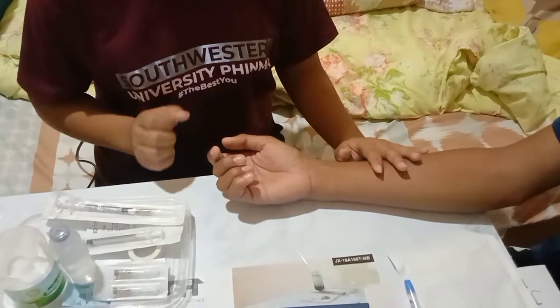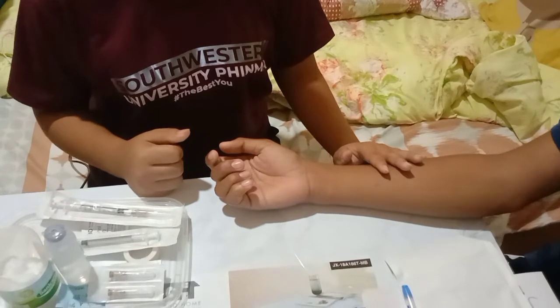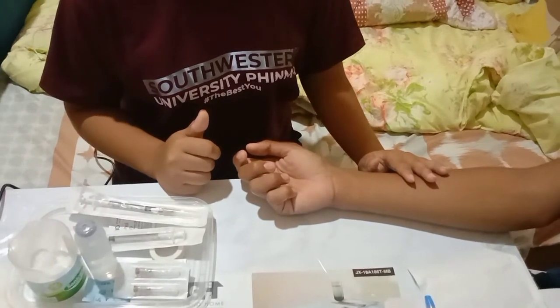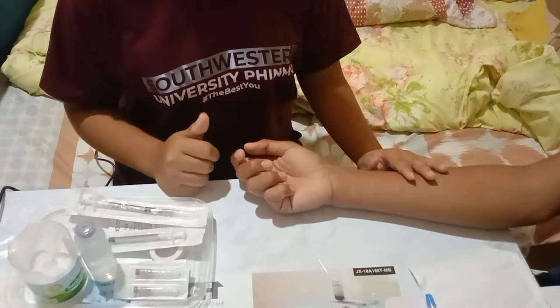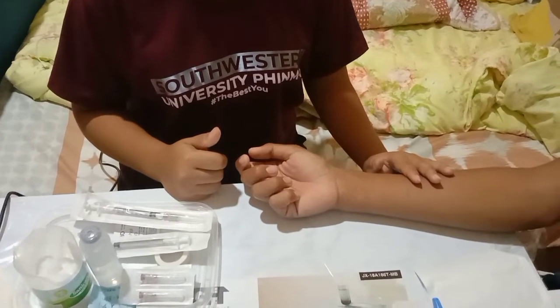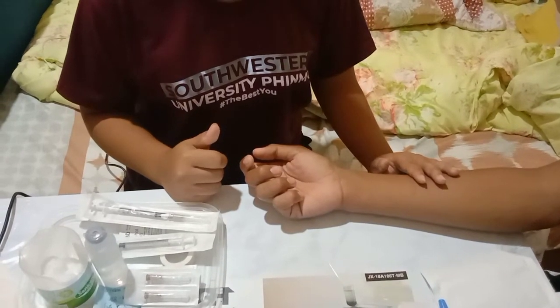Next is to explain to the client that the medication will produce a small wheal, sometimes called a bleb. A wheal is a small raised area like a blister. The client will feel a slight prick as the needle enters the skin. Some medications are absorbed slowly through the capillaries into the general circulation, and the bleb gradually disappears. Other drugs remain in the area and interact with the body tissues to produce redness and induration or hardening, which will need to be interpreted at a particular time, and this reaction will also gradually disappear. Provide for client privacy.